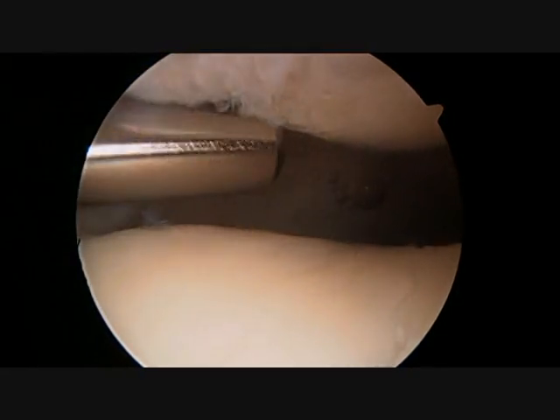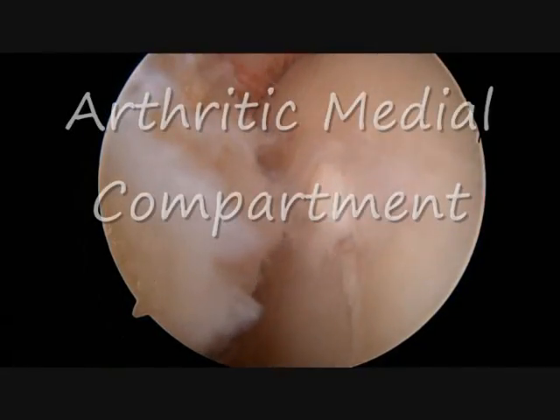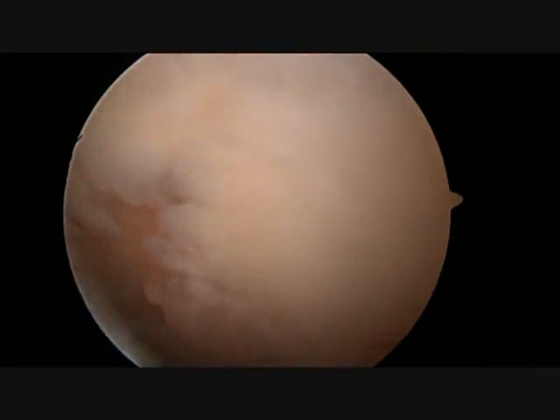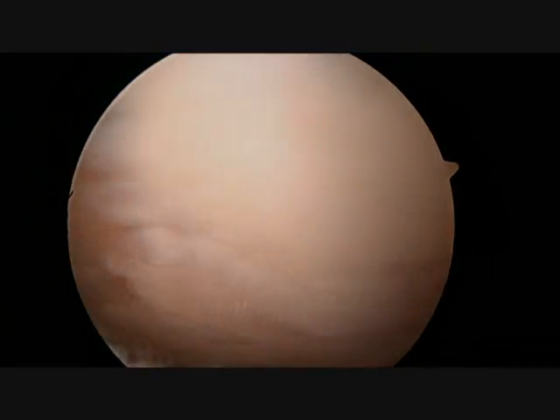A shaver is then placed into the knee. This is used to mow the grass and smooth out the rough and hairy edges of the cartilage. An osteophyte or bone spur, which forms in response to arthritis, can clearly be seen.